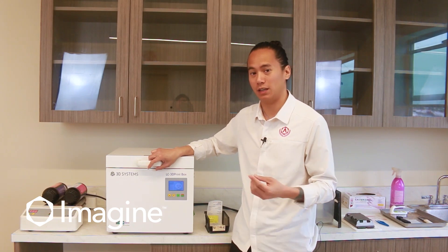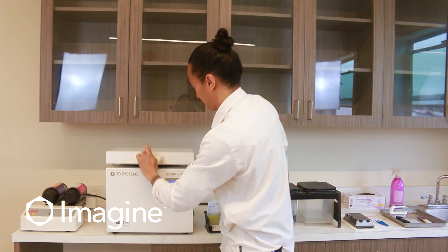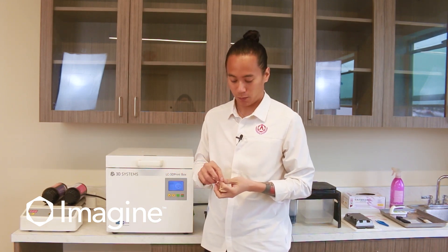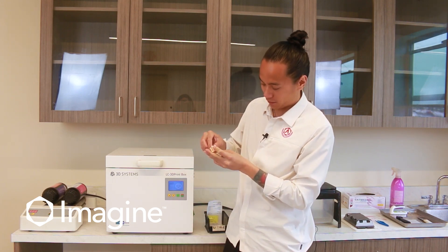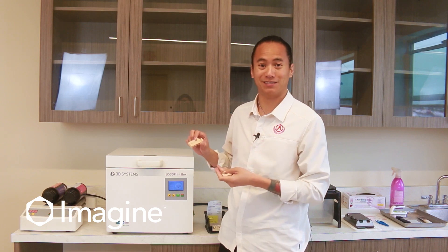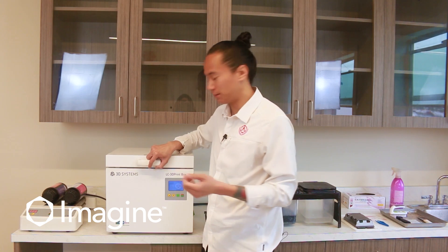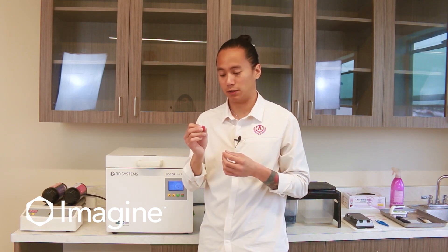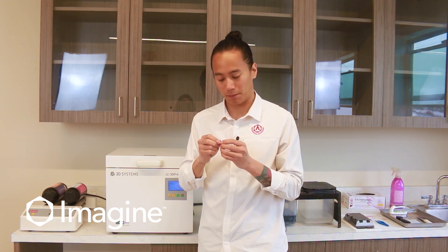Once your models are done in the light cure box, take them out and double-check them — they're ready for quality control. You can take your analog at this point and set it into your model to make sure everything is fitting properly. The last part of this model was the gingiva. Since we left the connectors on because some parts of the gingiva were thin, you can at this point just remove them by hand.